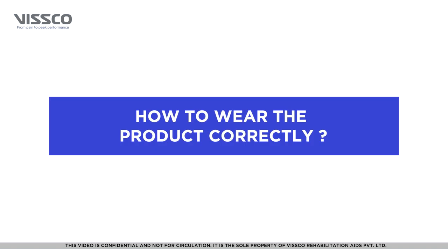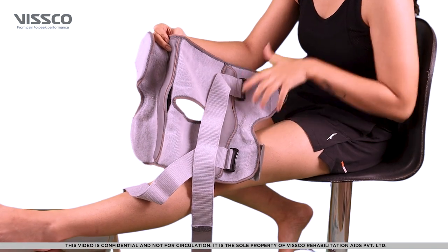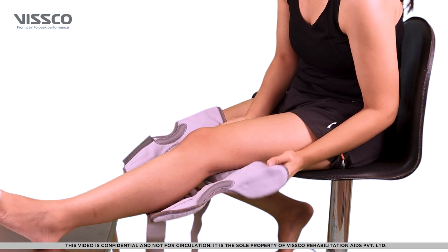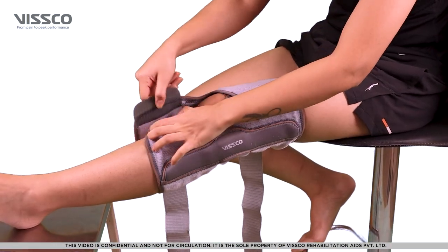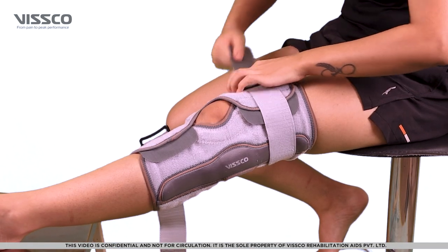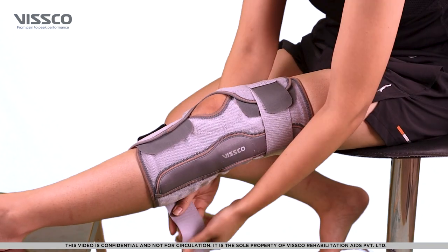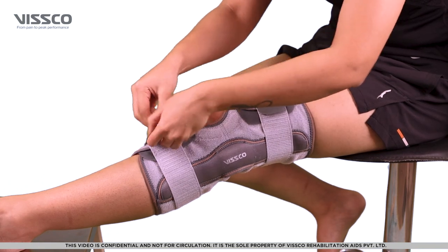Now that you have selected the right size, let us wear the product. Place the brace so the opening on it comes exactly behind the knee. Lock the brace with the velcros on the front. Make sure the area over the patella is left open. Finally, pass the upper and lower straps through the buckle and reverse lock to a comfortable and snug fit.